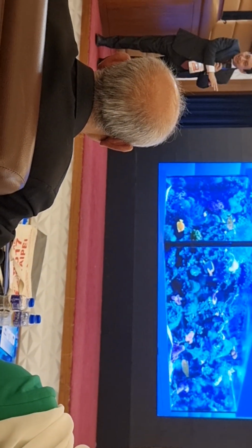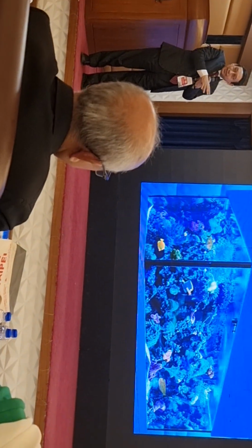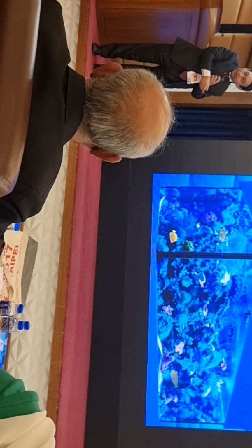In many of your houses, you have an aquarium. In a certain location, you will see that you have two fish, but you will see it is number 4. That is the refraction artifact. And when we are doing ultrasound, we are facing this problem again and again.